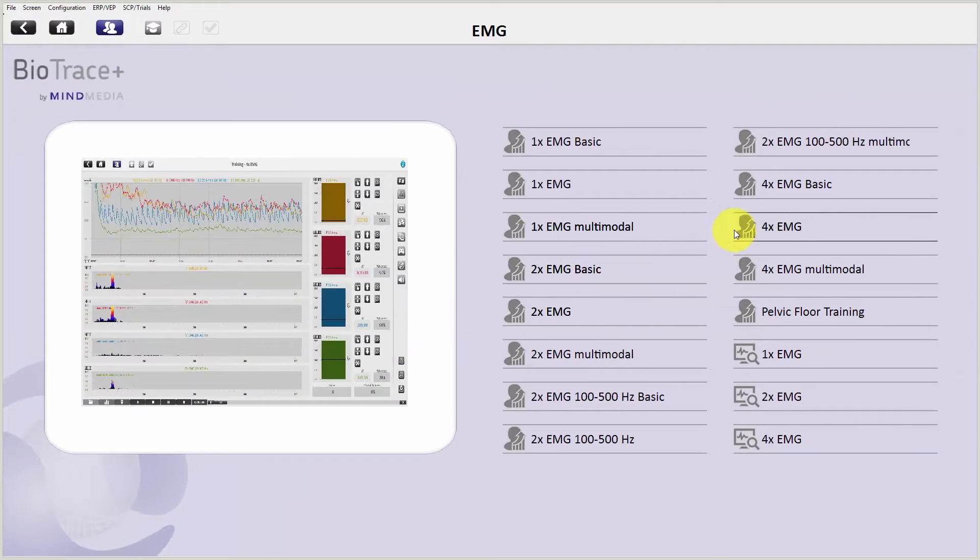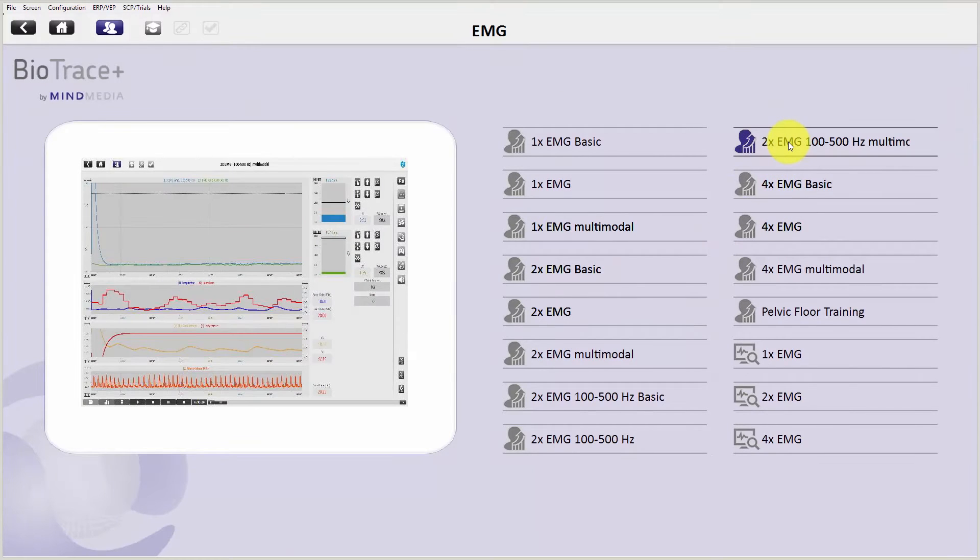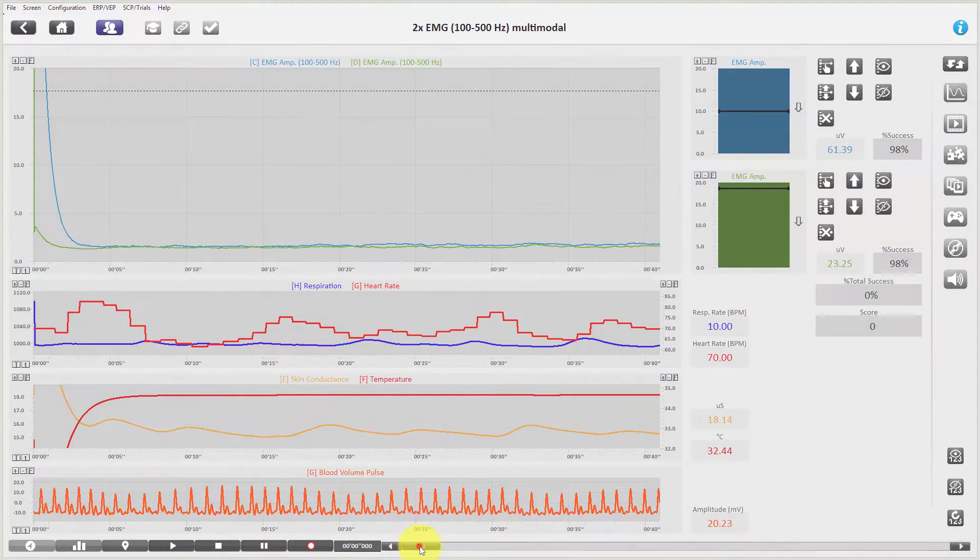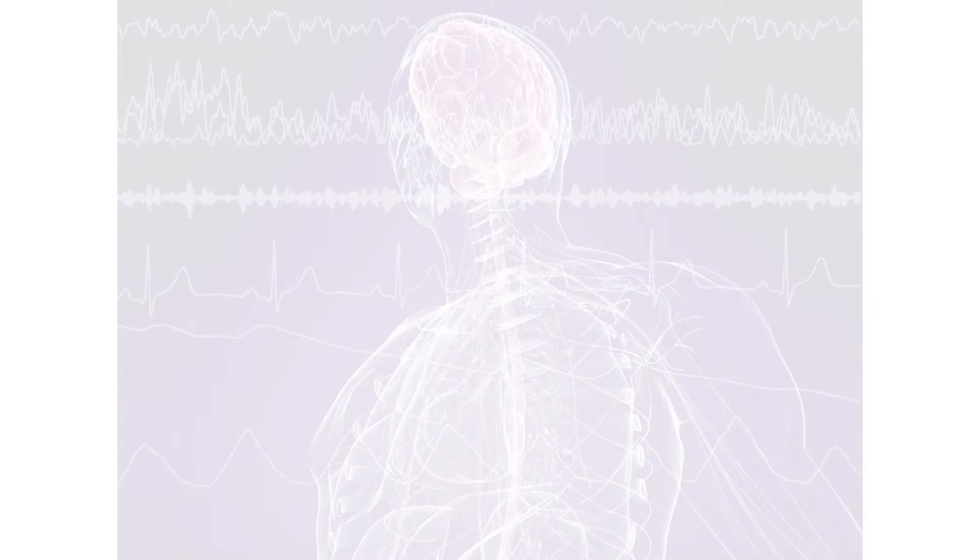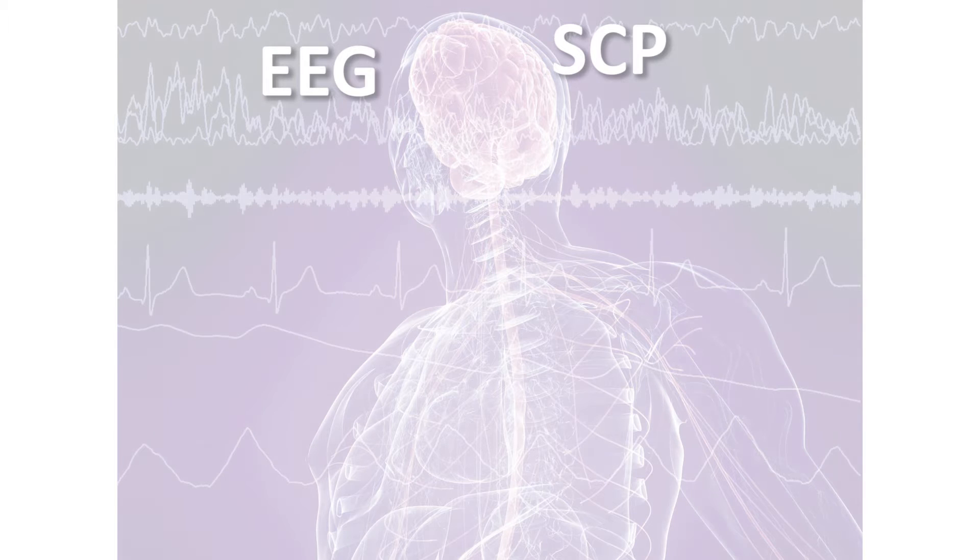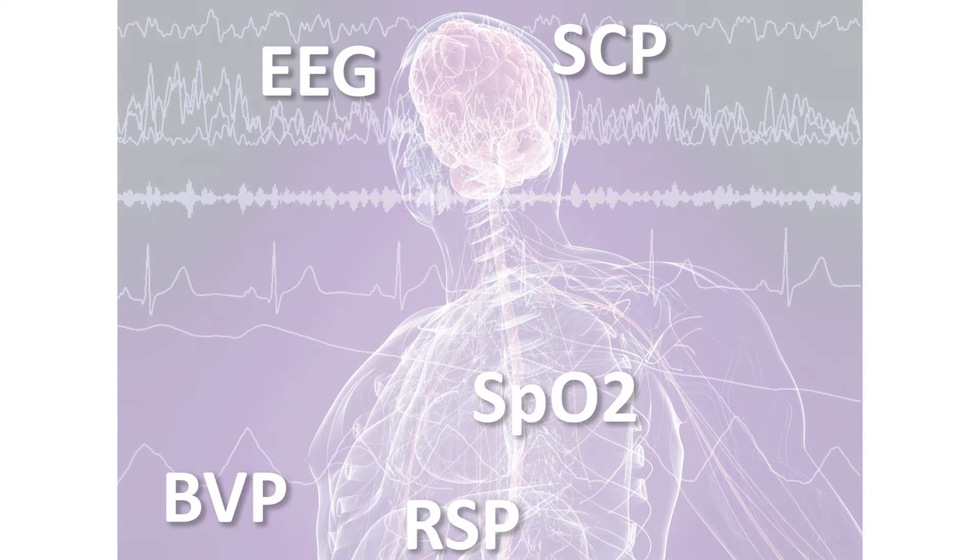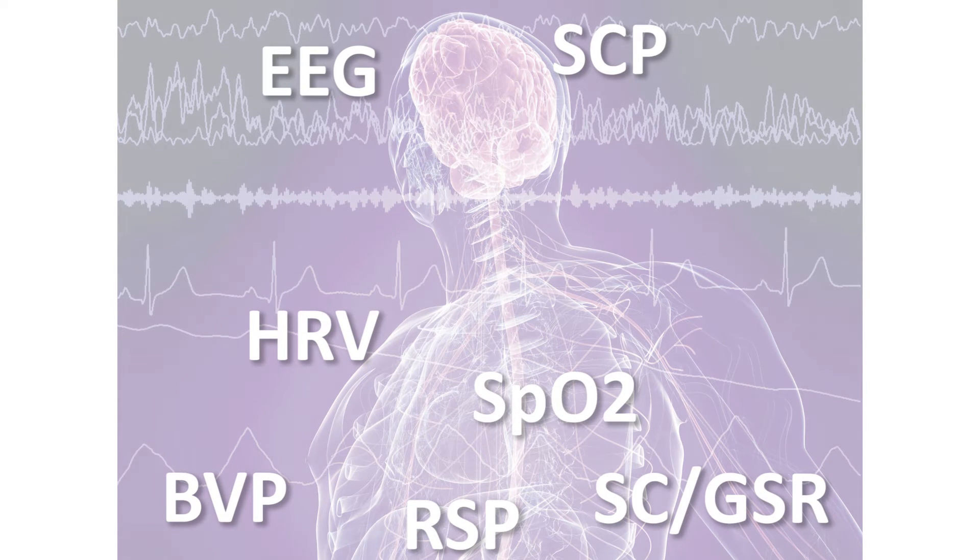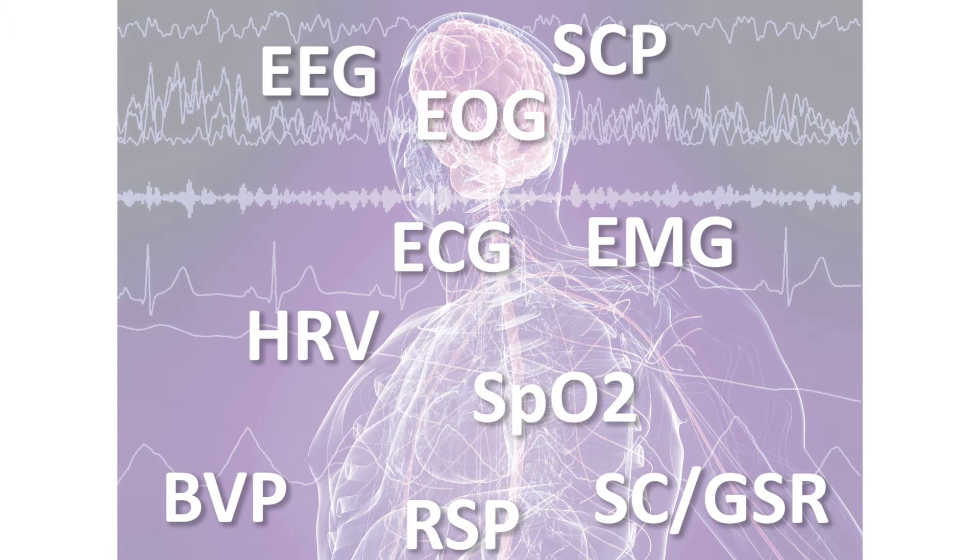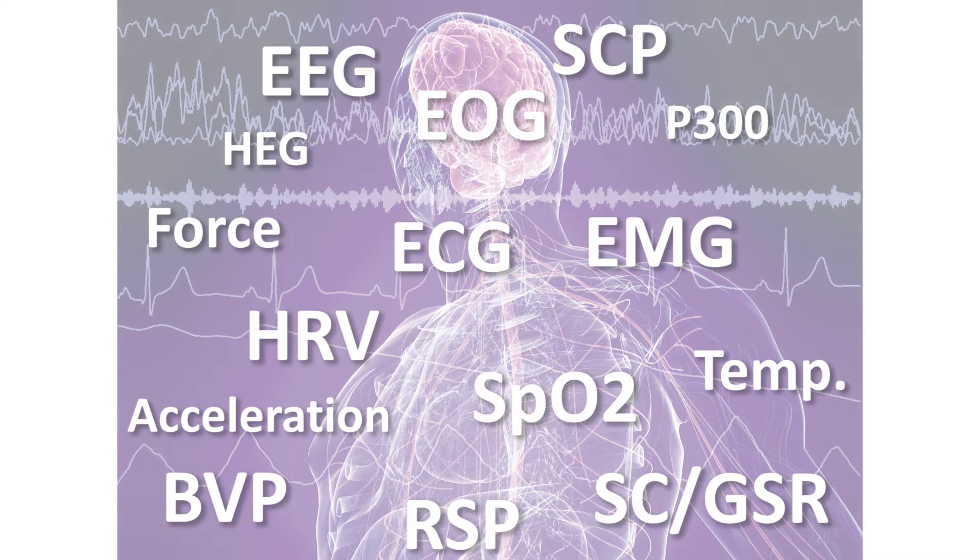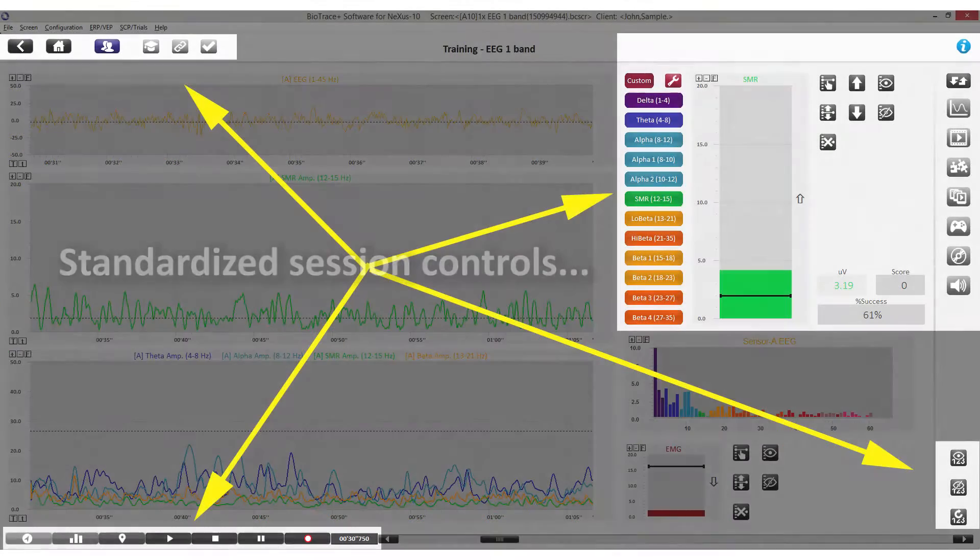The new screens all follow a standardized design, so once you know how to use one of them, you know the basics of all screens and applications. No matter whether you work with EEG, SCP, or with modalities like blood volume pulse, respiration, oxygen, heart rate variability, skin conductance, EMG, ECG, and others.